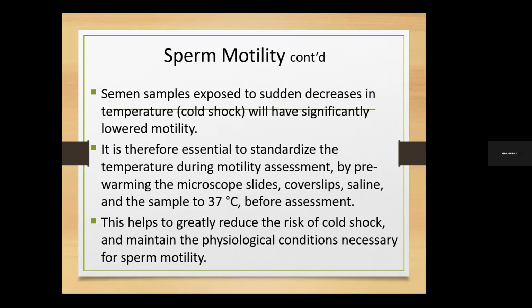I've said over and over again that as you go through the program, you may already be doing semen analysis. You can improve on it by trying to incorporate some of the things we're talking about. Those who have not started at all must also make an effort to do what we are telling you, so that your results will always be credible, reliable, and of the highest quality.